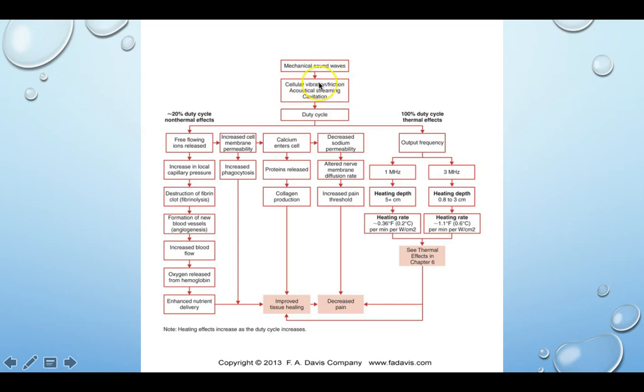Those sound waves are creating cellular vibration and friction and what we call acoustical or microstreaming and cavitation. We control how much of that happens with our duty cycles. And so if we have a 20%, 25%, 50% duty cycle, we might be targeting more of our non-thermal effects. If we have the 100% duty cycle, our main focus ends up being those thermal effects and what we end up with there, okay?